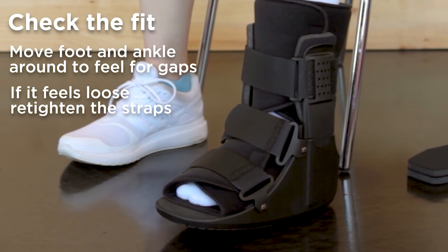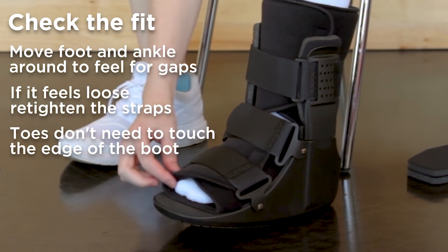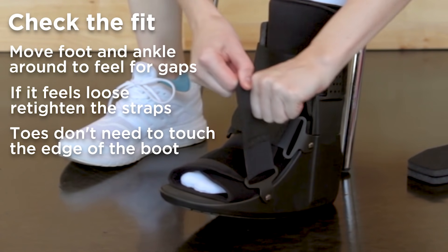As you can see, the boot is still effective even if your toes don't go all the way to the edge of the boot, as long as you have the straps as tight as they need to be.